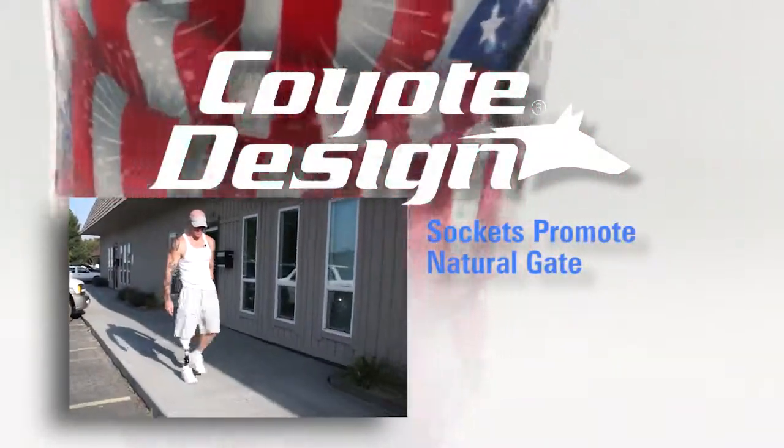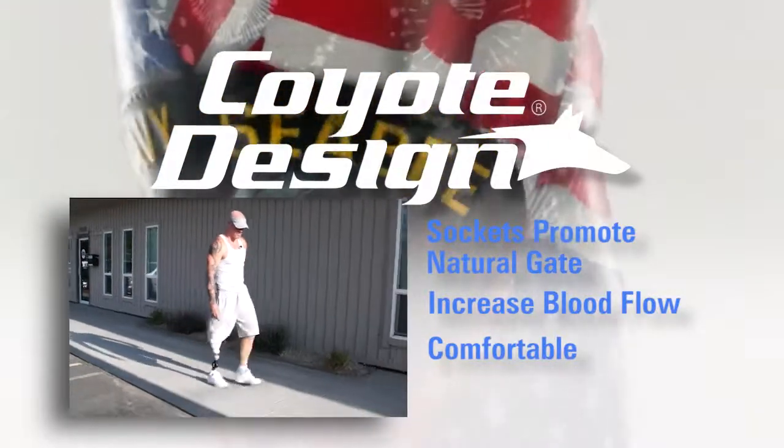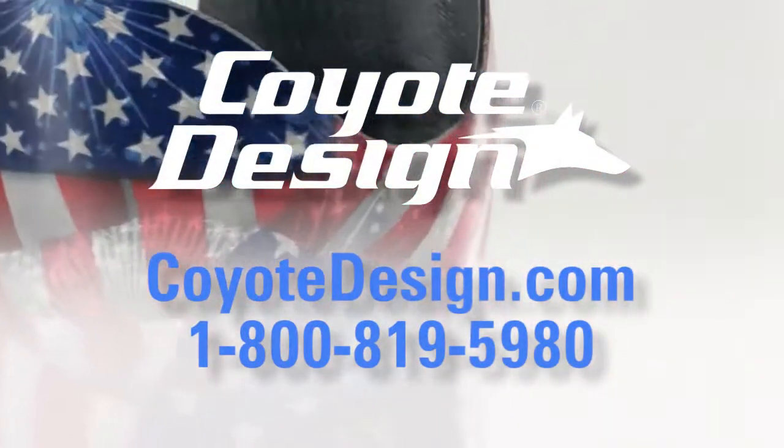You'll find these sockets promote natural gait, increase blood flow, are comfortable to wear even for long periods of time, and are efficient to make. Contact Coyote Design for more information on our informative RCR workshops.